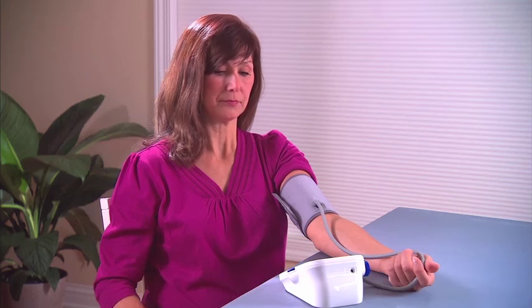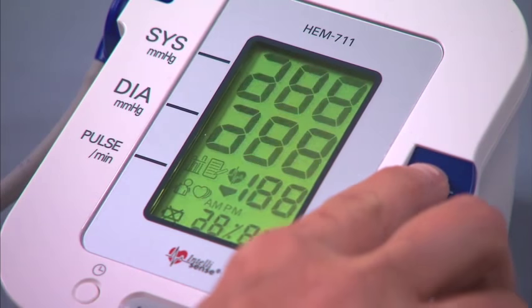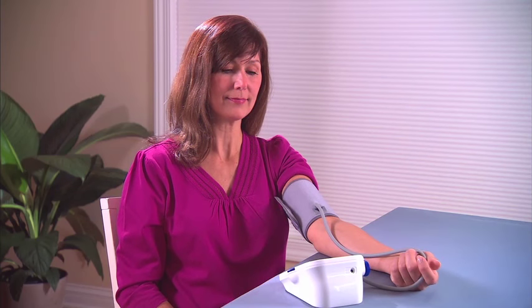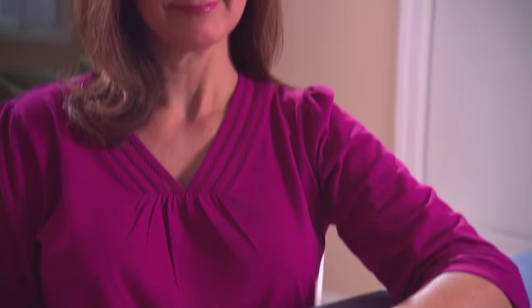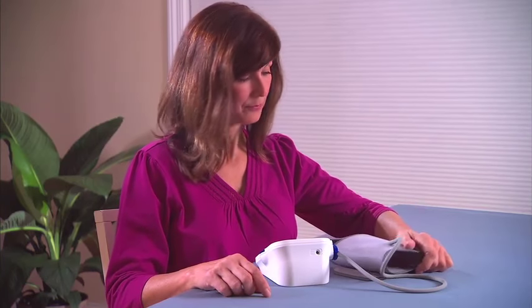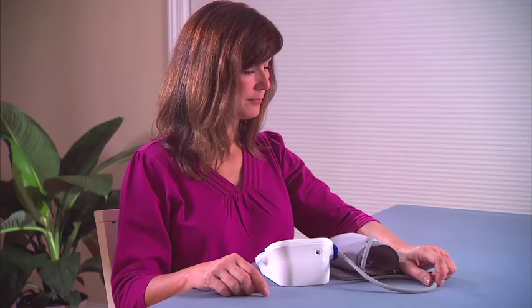To monitor your blood pressure using an automatic blood pressure monitor, find a comfortable place to sit with good back support at a table or desk. When you're ready to take your blood pressure, sit quietly for 3 to 5 minutes beforehand. Place your feet flat on the floor and rest your arm on a tabletop, even with your heart.